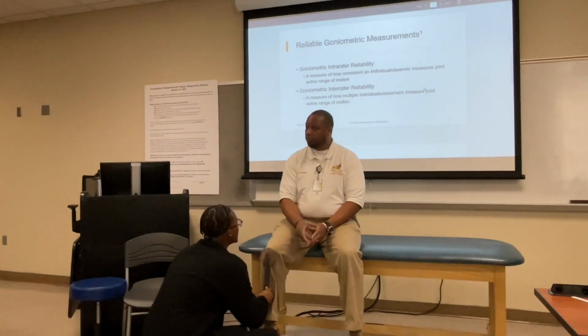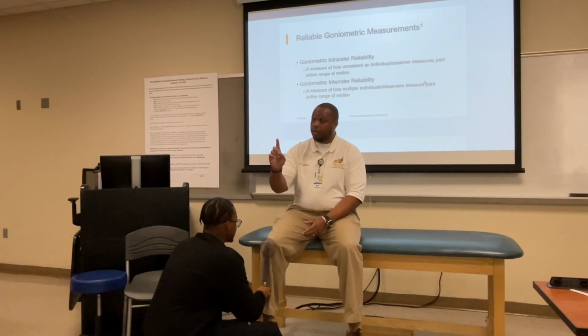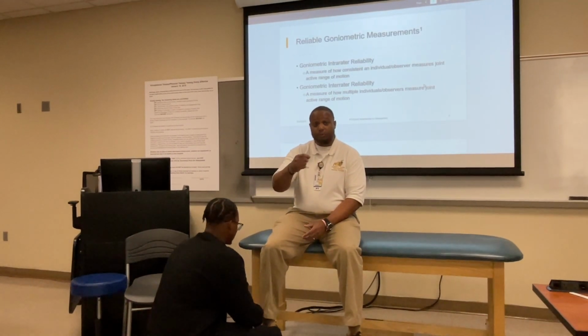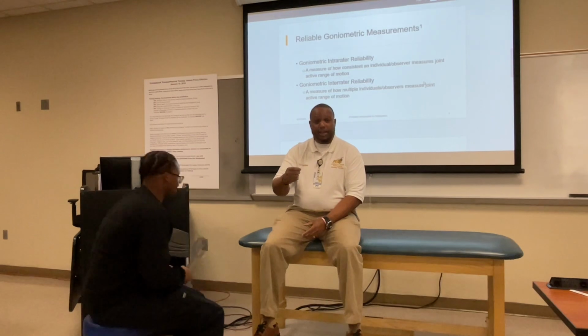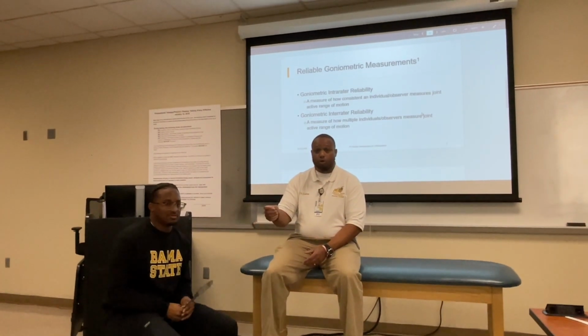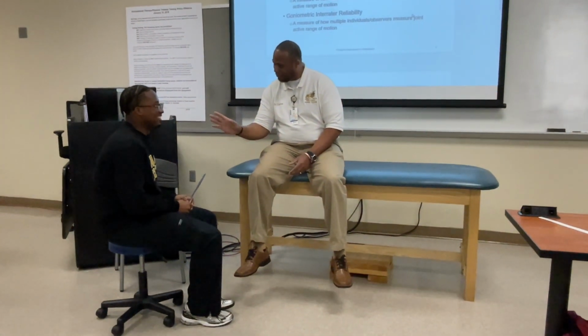As I'm presenting this, I'm teaching you all as well, right? For lab practical purposes, one of the items that we check you all off on is biomechanics, proper biomechanics. If he kneels like that, is he going to get all the points for that? Most likely he's not going to get any of the points. So this is just teach and learn. It's okay, Emory. I'm just going through it. All right, so go ahead.